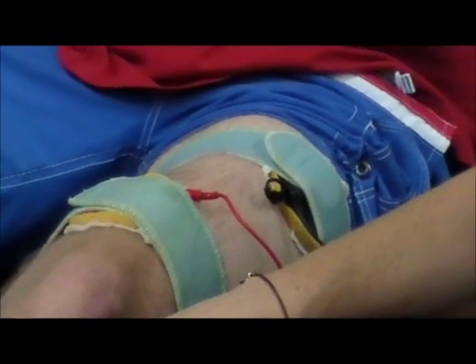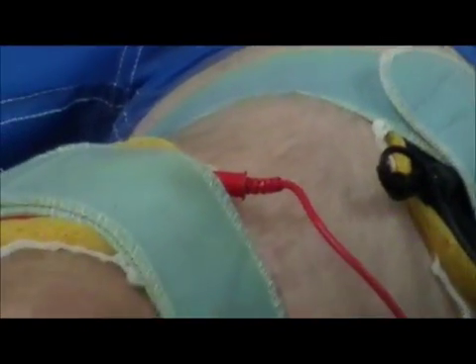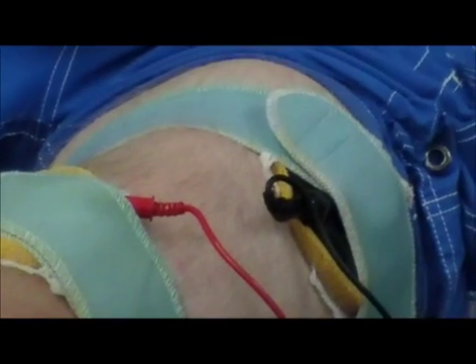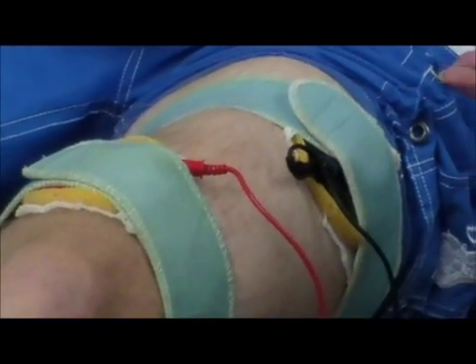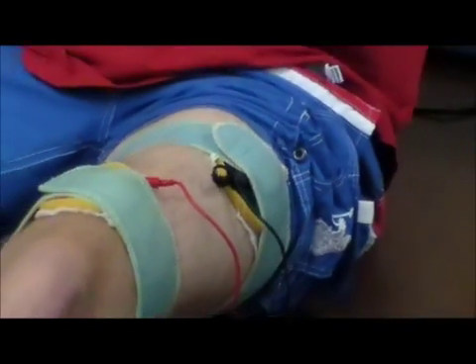So they don't have a surge option on that machine, so you wouldn't really use that machine. He's at almost 50 milliamps, but it's just going to do that. So for a spasm where you're wanting just to hold, fine. Or the sensory level for pain, you just turn it up to the sensory.